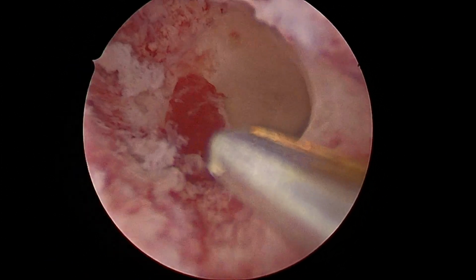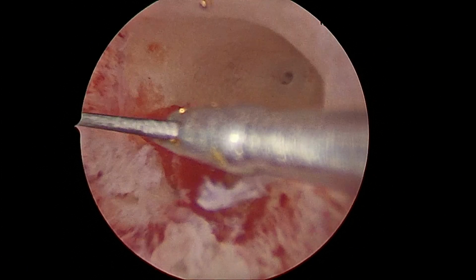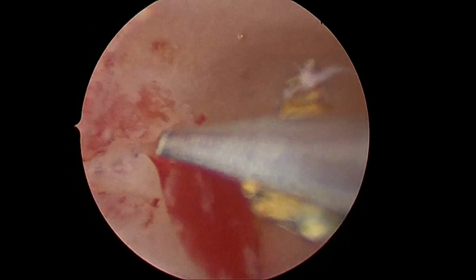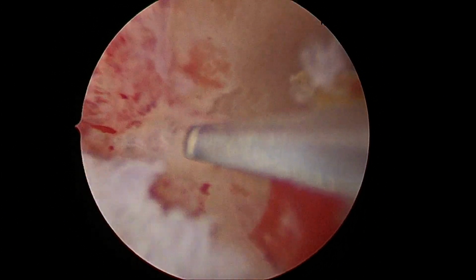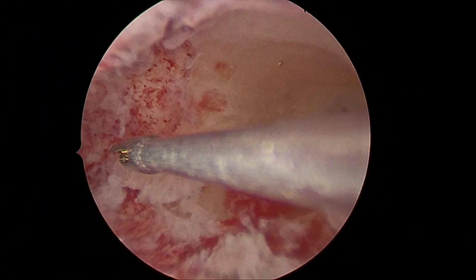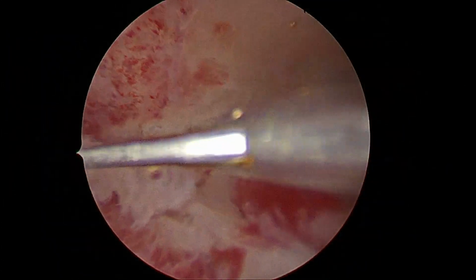It could be because of the previous surgery, which was released with the cold scissors to make the endometrial cavity as near normal as possible.